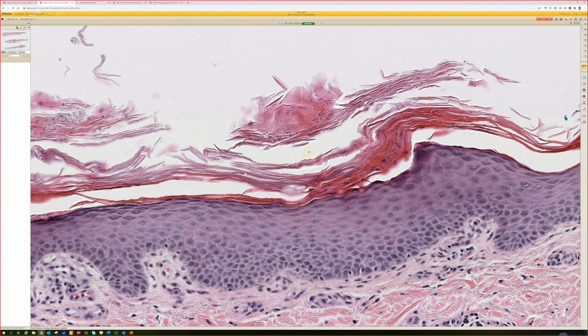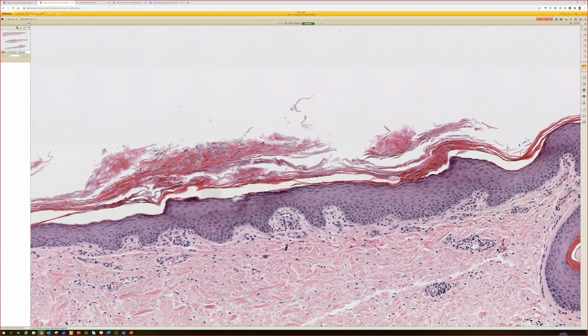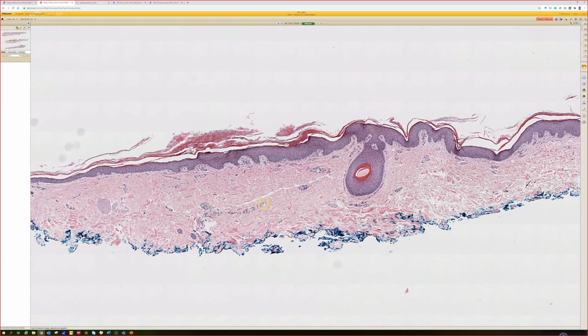And I feel like you guys recognize this clinically and don't usually biopsy it. The times I see this most often, I've seen it over melanoma, totally incidentally. I've seen it over top of an AK or a squamous cell carcinoma in situ. So I tend to see this as an incidental Tinea versicolor finding where there's actually hyphae and yeast, in the setting of the dermatologist doing a biopsy for something else that was the actual lesion, and this was just like a bonus finding. I actually had a case of that not too long ago.